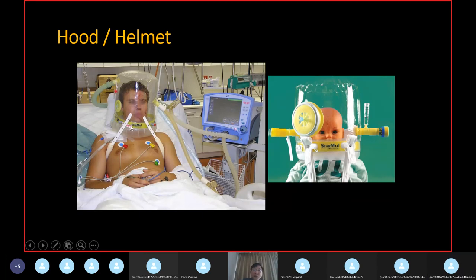The reason why they used this in Italy and the Spanish group is that the exhalation gas can be controlled, right? So for this exhalation gas, there usually is a port here, right? The pressure gauge port. Sometimes we can put a HEPA filter here, right? So the air from the patient does not go directly out, but goes through the filter. So that makes the environment much safer, okay? All right.